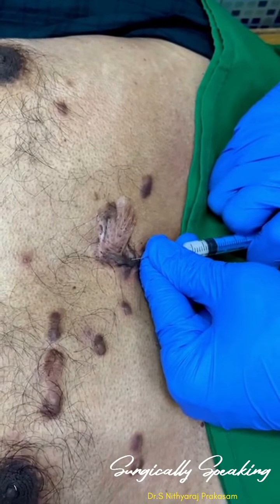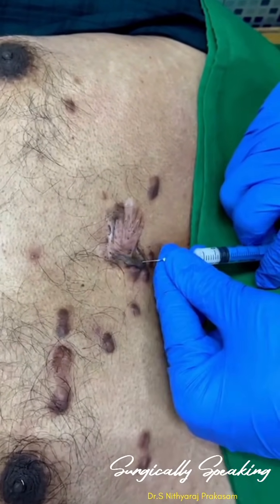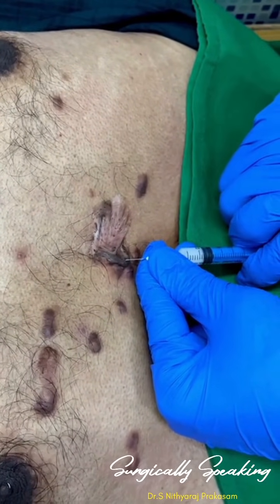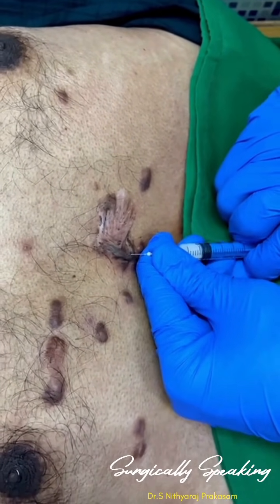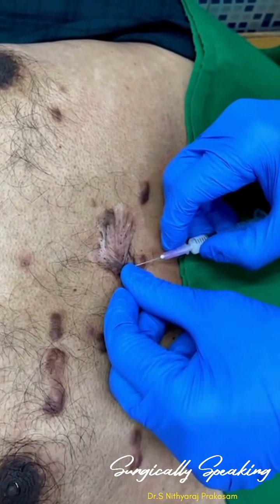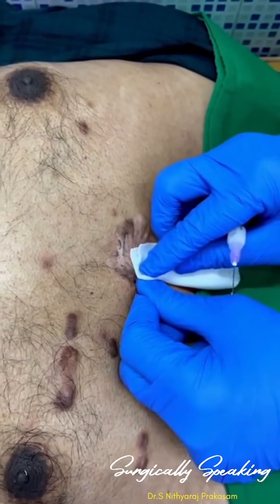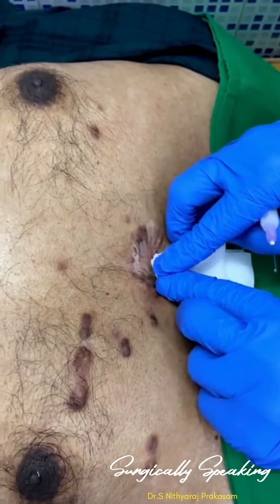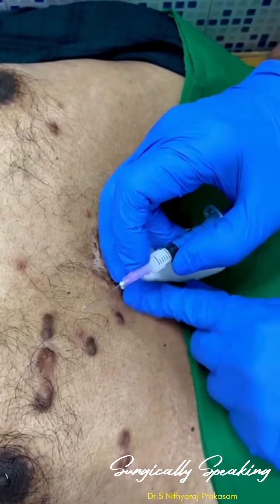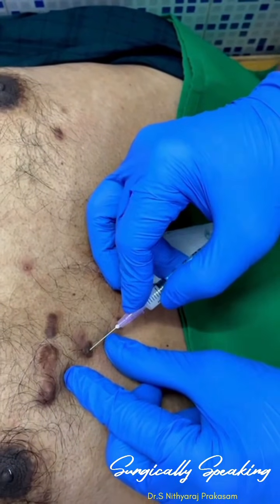So, yes, now I have broken some fibers there, and now my injection is going freely. And if it's going freely, I'm not going to inject further. I'll just choose another site. Give me a gauze. Usually through the puncture hole, the medicine comes out. The maximum dose you can give is about 40 milligram. I am giving 40 milligram here.